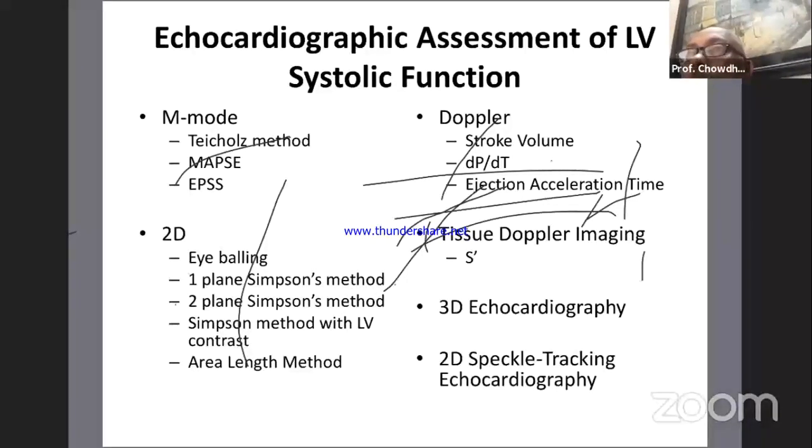At times when the patient has wall motion abnormality, as a cardiologist we have to face all these wall motion abnormality cases because these are rather our point of interest. And in those cases, probably with one of the methods, Doppler or tissue Doppler, and if available 3D echocardiography, we can recheck whether our measure of ejection fraction is near accurate or not.